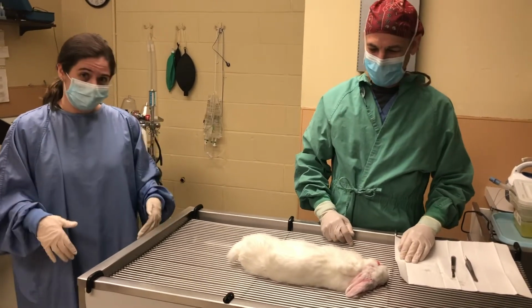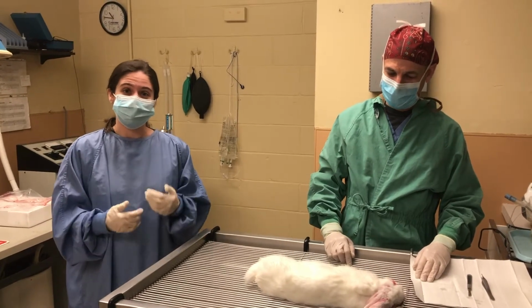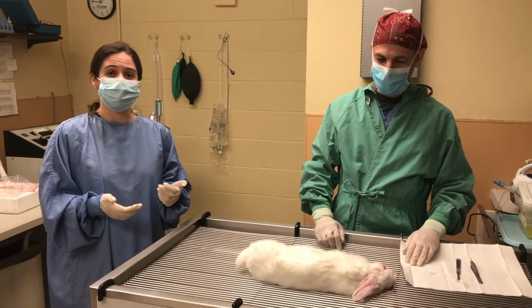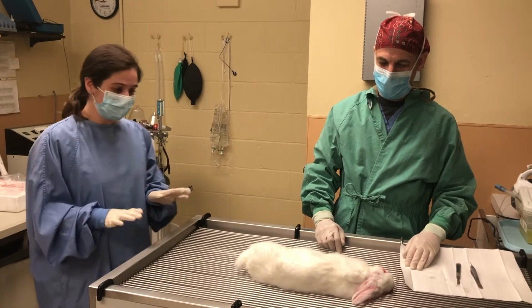And you'll notice we are in our PPE, our personal protective equipment. We have our masks, we have our gloves, we have our gowns. And this is to make sure that any potentially harmful materials or substances don't come in direct contact with us.